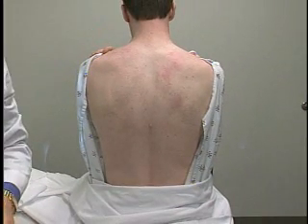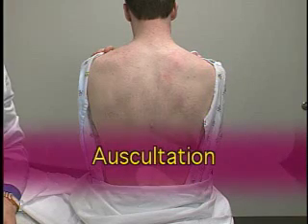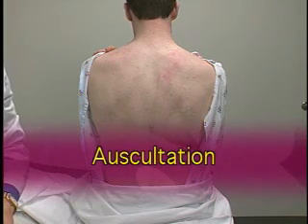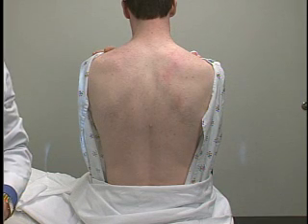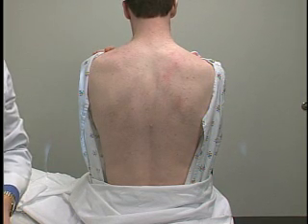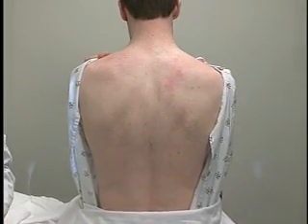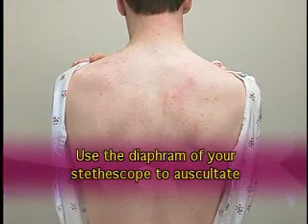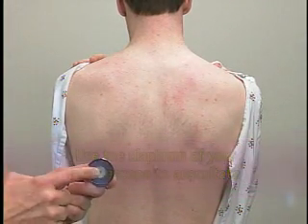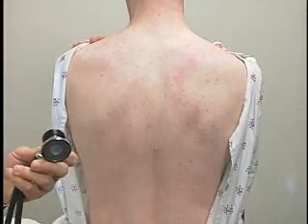The next part of the pulmonary examination that we'll demonstrate is the technique of auscultation. For auscultation, you're going to also start at the top of the lungs and also compare side to side as you auscultate. You also use the diaphragm of your stethoscope rather than the bell. Again, use the diaphragm of your stethoscope to auscultate.